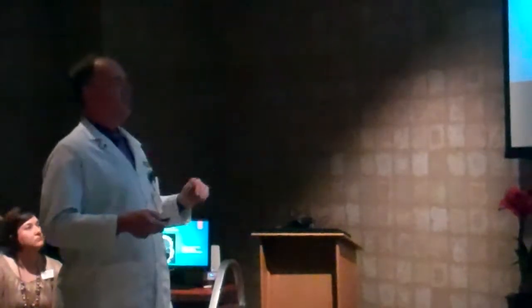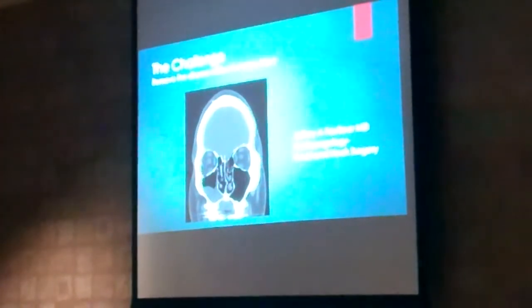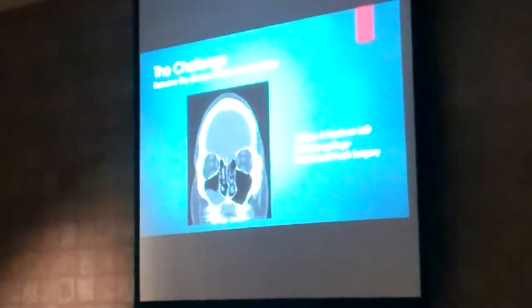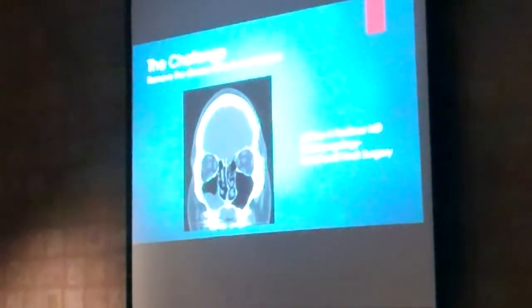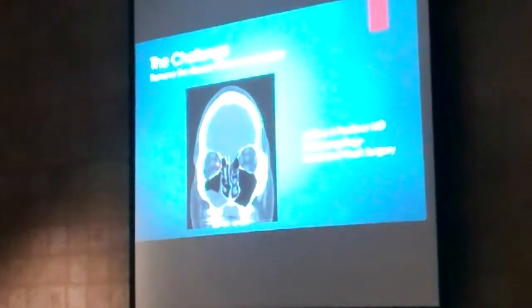around it. So if this is a CT scan, it's like you're looking in a mirror. If this was your face, it's like you're looking in the mirror, and anything white is bone. So that's the skull up here, and this is the orbital bones, and these are the eyes, and those are muscles in the eye. Anything gray is soft tissue, like the skin up here, and like the brain, and the muscles inside the orbit, and then the eye as well.